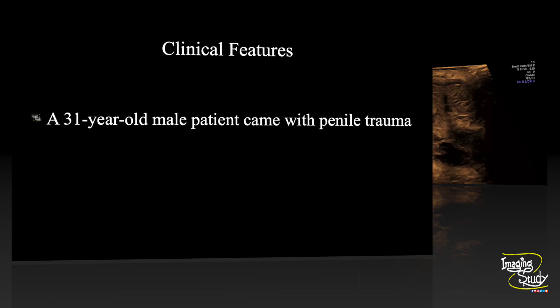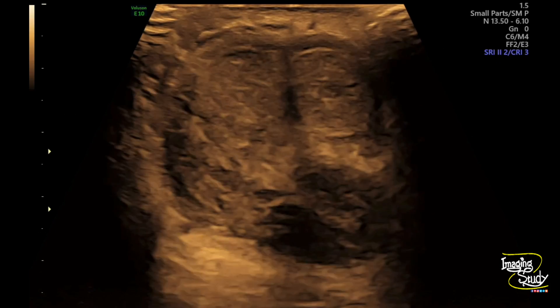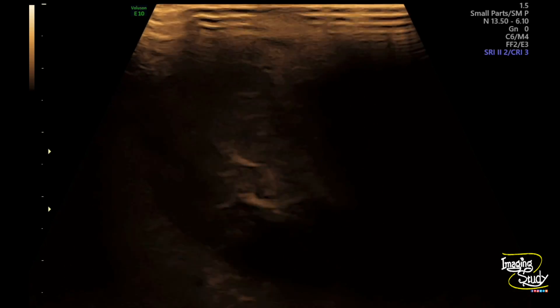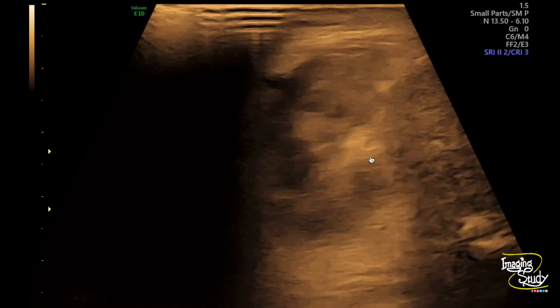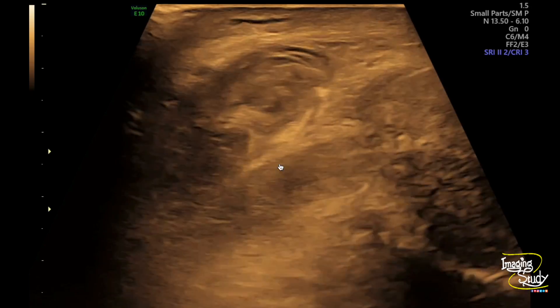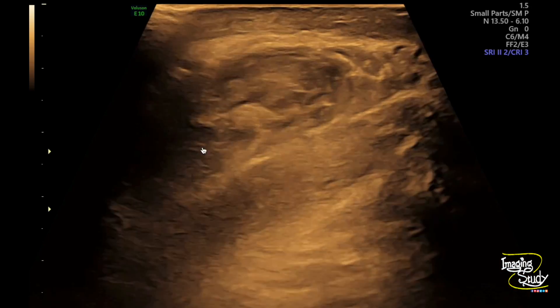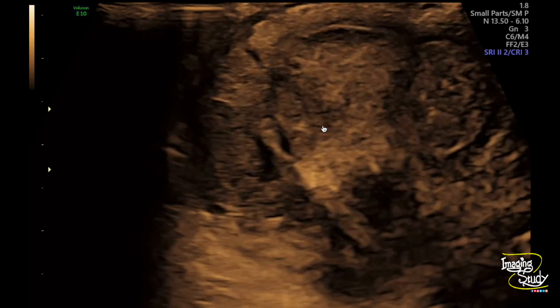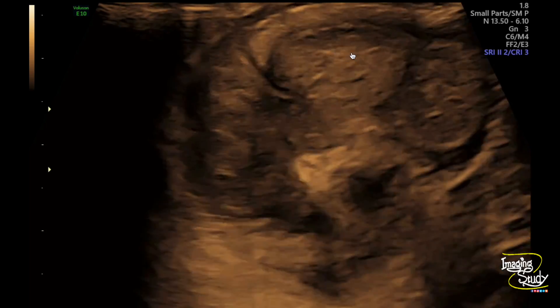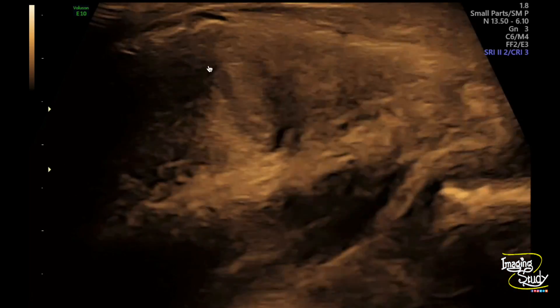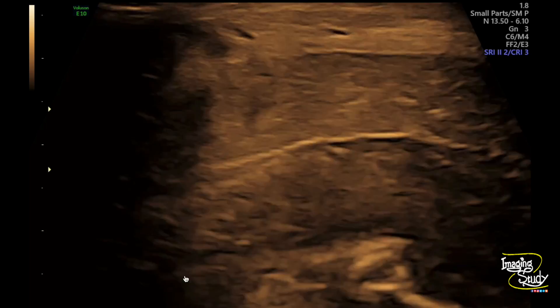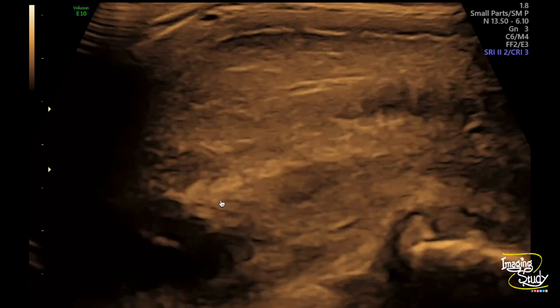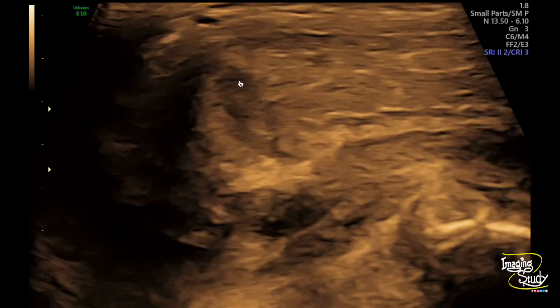On ultrasound, here you can see the transverse section of the penile region. You can see the corpora cavernosa. There is a heterogeneous peri-albugineal collection here. This collection is getting connected with the right corpora cavernosa at the root through a defect in the tunica albuginea. So we have corpora cavernosa hematoma with a defect in the tunica albuginea and peri-albugineal extension.